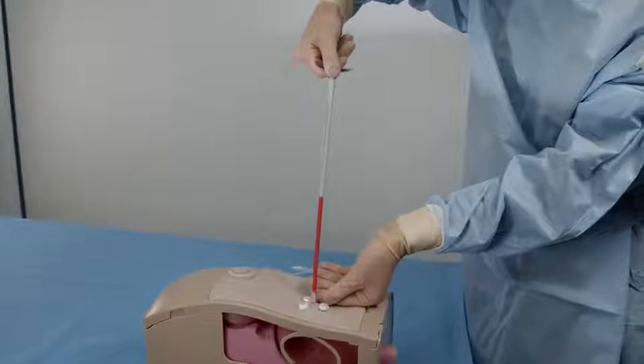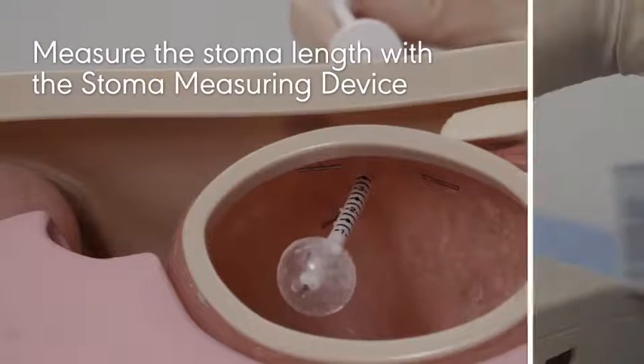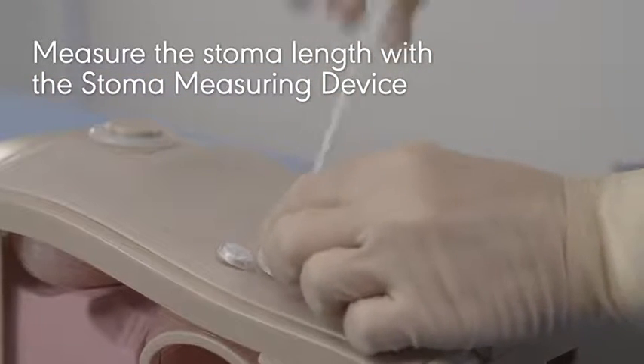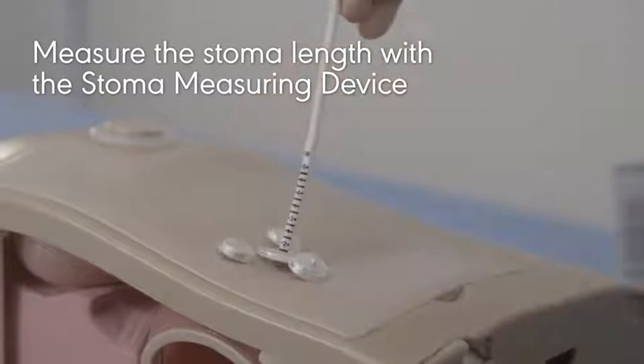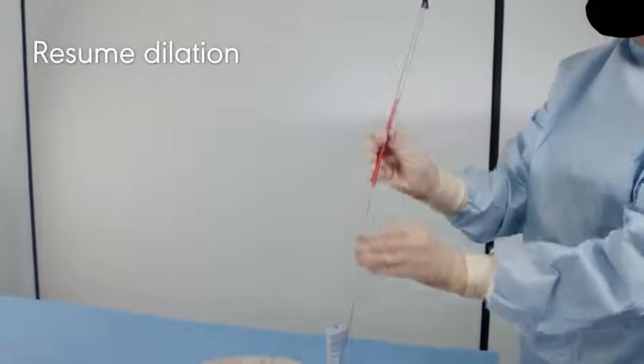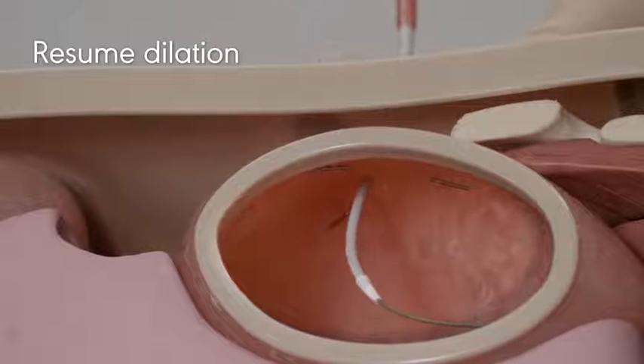Then remove the dilator from the stoma and measure the stoma length with the stoma measuring device. After measuring, remove the stoma measuring device and resume dilation by advancing the dilator over the guidewire, through the stoma tract, and into the stomach.